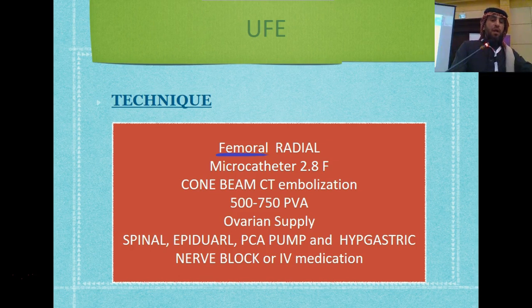We try to use larger particles. In the old days, we were using smaller ones. That's why the ovarian failure is less. We always check for the ovarian supply, and for the pain control, as you all know, the patient will suffer from pain post-embolization. It's a different protocol, either spinal or epidural. In our institute, we are using the PCA pump.